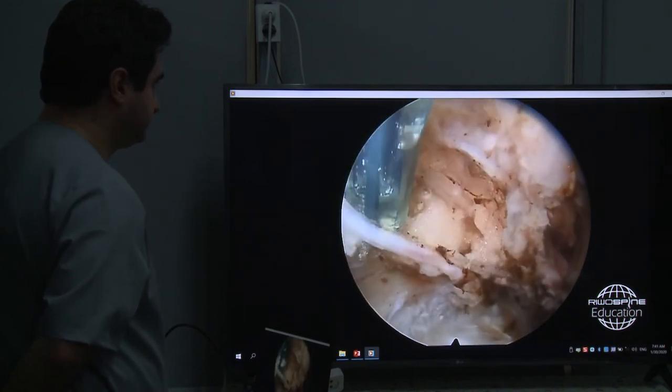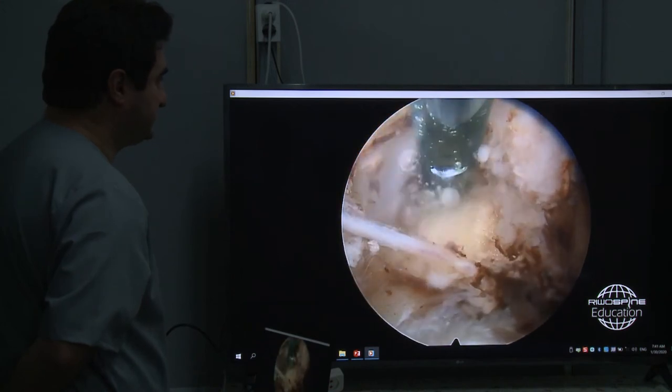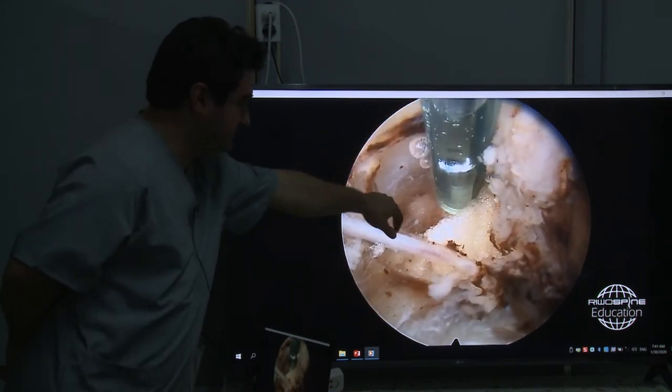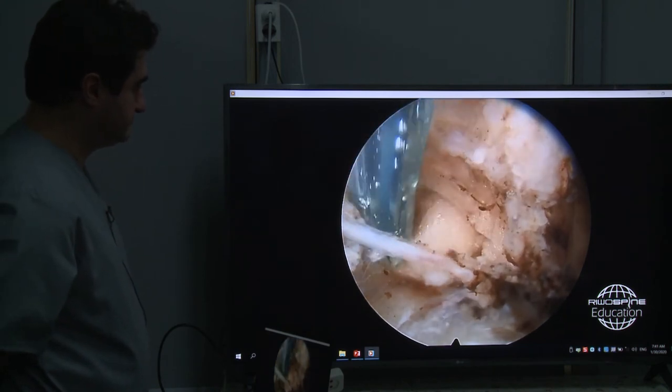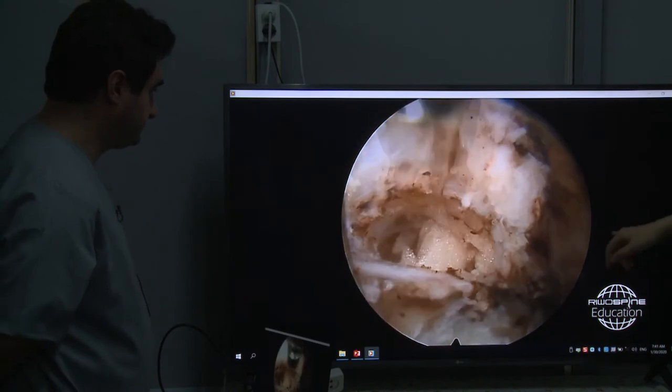Want the root demonstrated? Yes, he wants to demonstrate. Here comes the exiting nerve root, yeah? So this is the exiting nerve root. And we are here on the way to the axilla. Yeah, yes, this is another one.